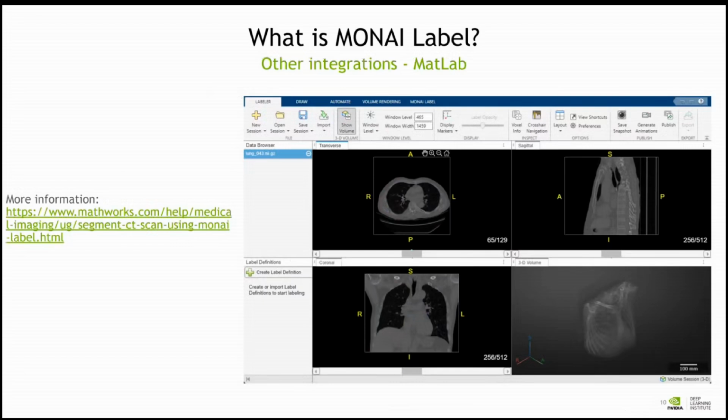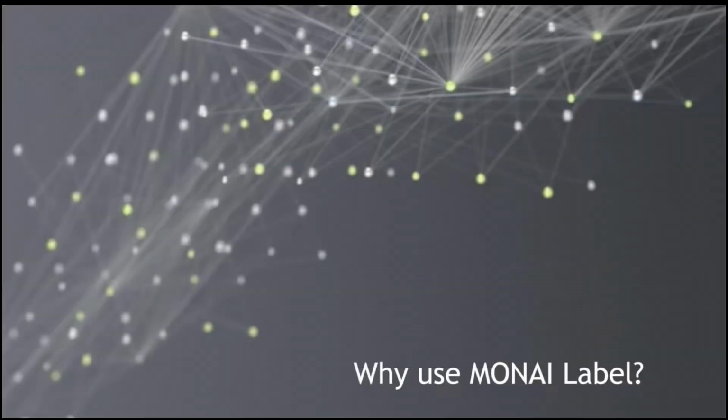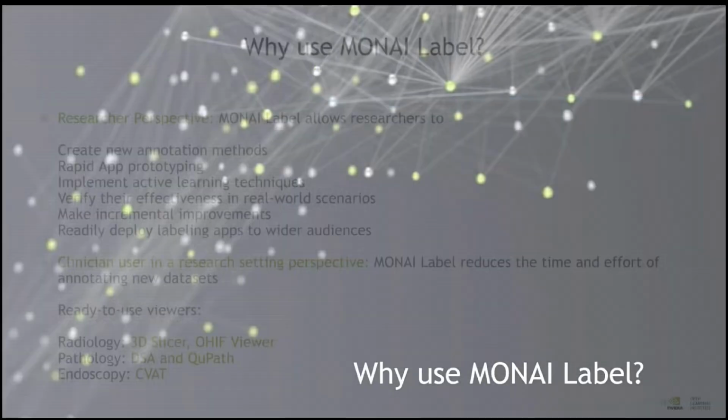Recently, I think MITK also integrated MONAI Label with that. Yeah, so why should you bother using MONAI Label?